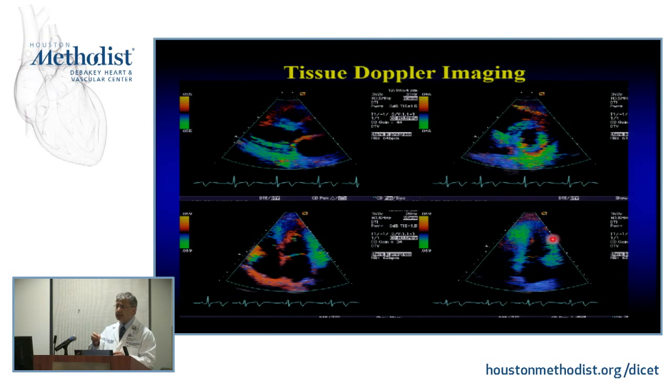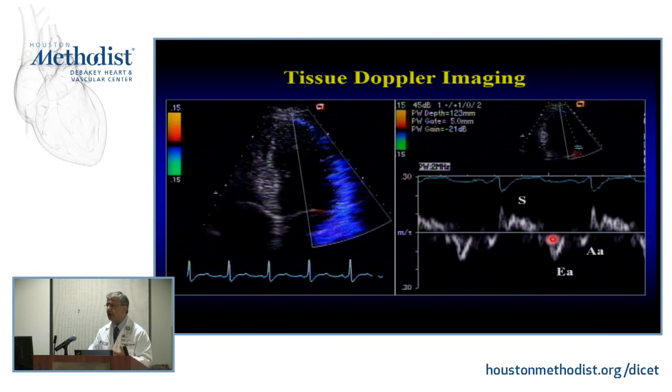Meaning, the pulse Doppler intensity coming from muscle is very high intensity, low velocity. All right? Heart muscle moves very slow. But coming from a muscle as opposed to a red cell, the intensity of the signal is very high. So I have high intensity, low velocity versus low intensity, high velocity. So I can display either. That's how we displayed blood for many, many years. And now we've discovered that there's a lot of information in the muscle, right? So that's all the tissue Doppler applications that you see.